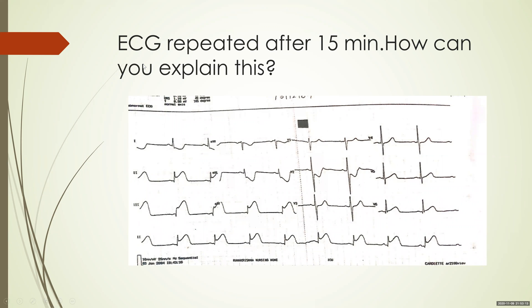When in doubt, always repeat the ECG. If you have doubt about what is going on, take another ECG — you will often get the answer from that. A repeated ECG now shows ST elevation in leads 2, 3, and aVF. The lateral wall MI changes have disappeared; instead, you have ST elevations in 2, 3, and aVF with reciprocal changes in 1 and aVL — this is again an inferior wall MI.